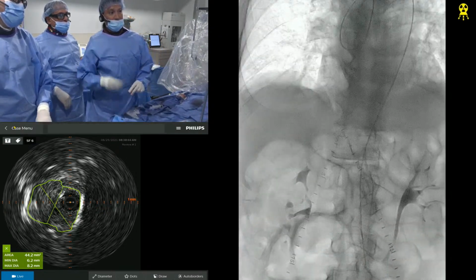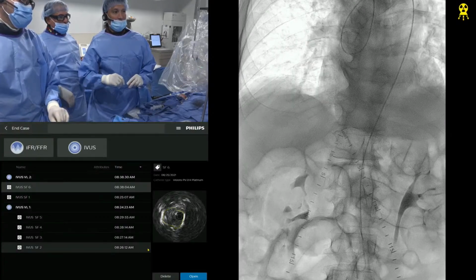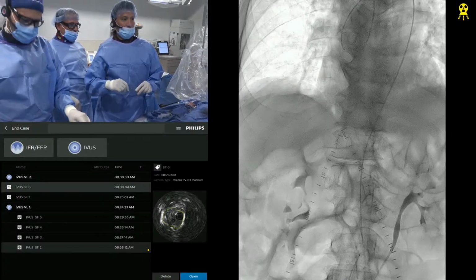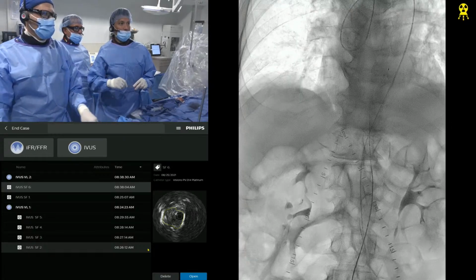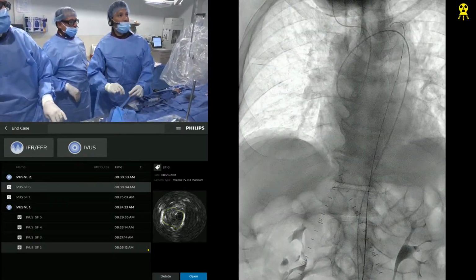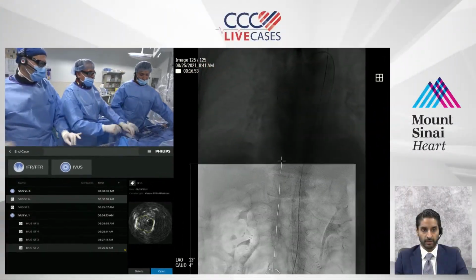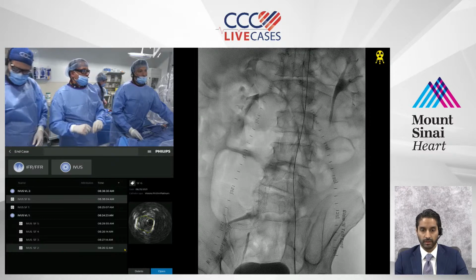Well, that's the question. I think let's analyze it once we get the wire up. Before we get access, let's analyze. Let's discuss, and let's see whether we can do it without. Dr. Guja, you're hitting on a very important level of complexity in this case about what is the best stenting approach, knowing all the data that Luke had very well gone over.